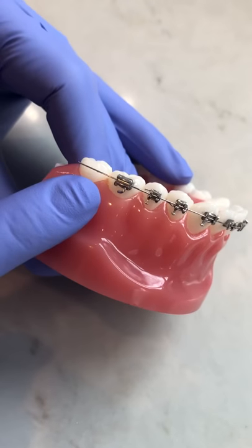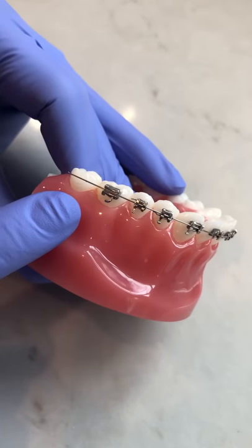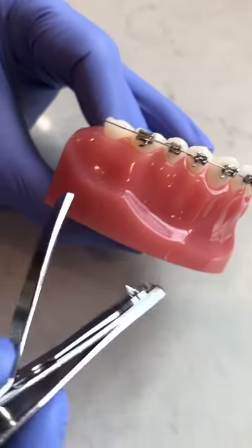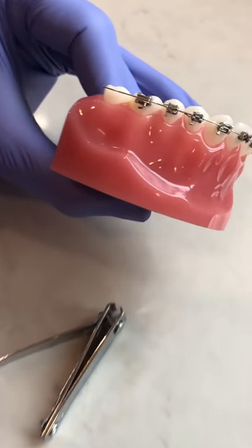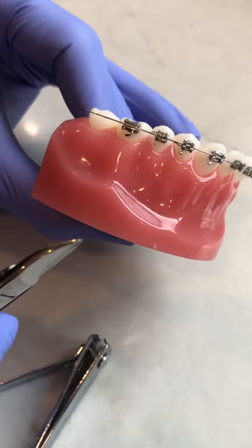If the wire is long and poking you and it's really uncomfortable to the point where you can't use wax to make yourself comfortable, you can clip the wire. You can use a nail clipper or you can use a small scissors. Whichever you choose, make sure that you've alcoholed and cleaned it thoroughly.